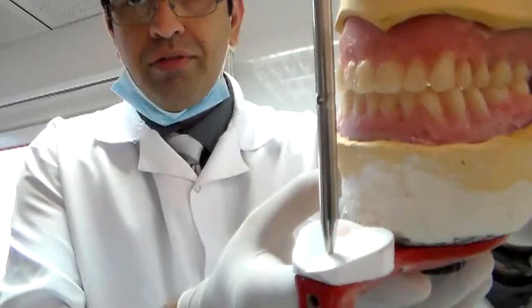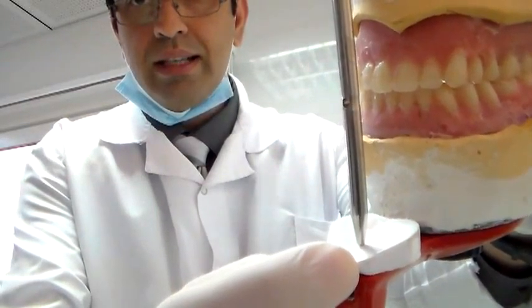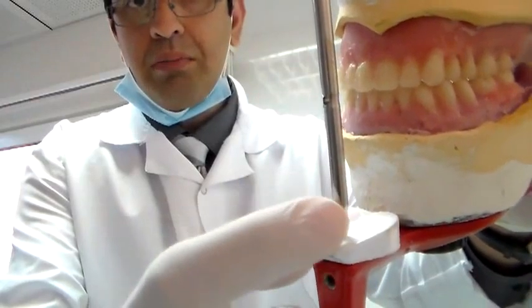Number one, you want to check if this pin — the vertical pin — is touching on the table, on the incisal table. If the pin is not touching, that means the vertical dimension has changed.